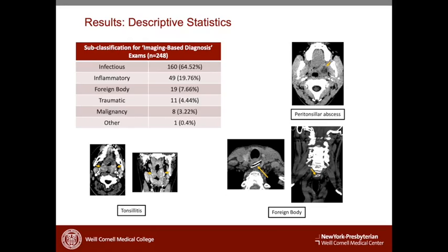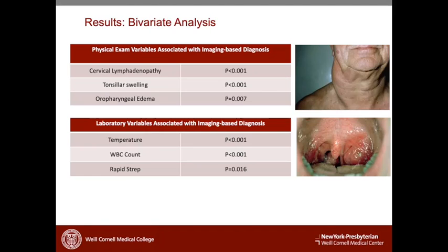Here we have some examples of exams that would be categorized as having an imaging-based diagnosis. Peritonsillar abscess and tonsillitis would be subclassified as having an infectious etiology.